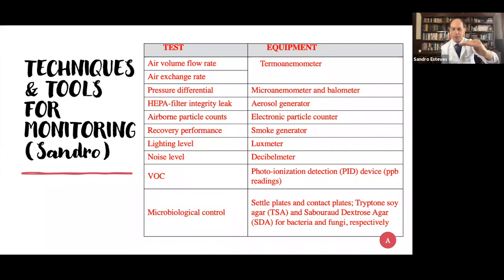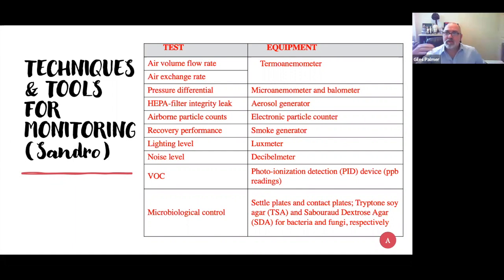Sometimes I see the monitor placed in an inadequate position. It should be where the embryologist is working, because that is where the oxygen level will go down and people could faint and have a problem. It has to be at the height of a person. So of course, if there is low oxygen, then we know about it. That's very important. There are also calculations you can find on the internet for how many storage canisters you should have in a certain type of room.